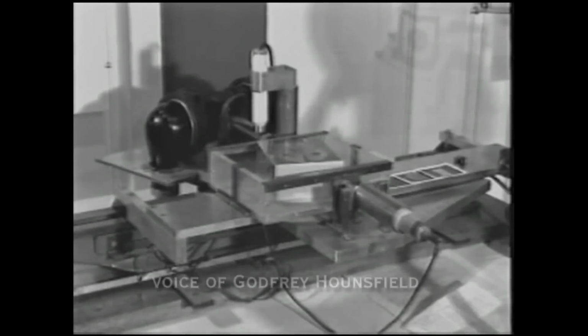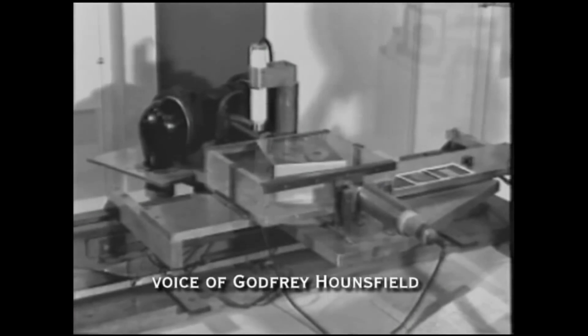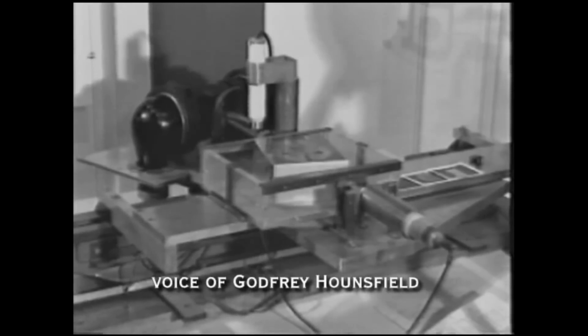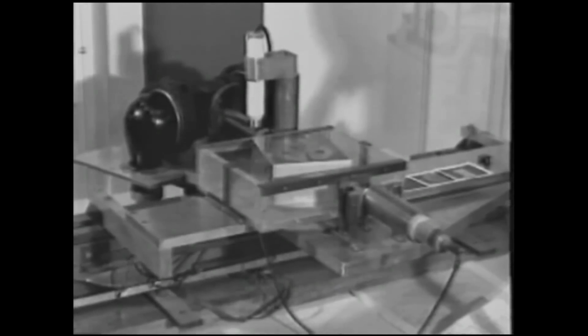And this is the first image generated by the second prototype. Because of the X-ray source, the image was acquired faster and provided more detail than the first prototype. As it happened, an old lathe bed was available in the lab, and by using discarded equipment also found around, I was able to build this lab test machine which would demonstrate the principle of the system.